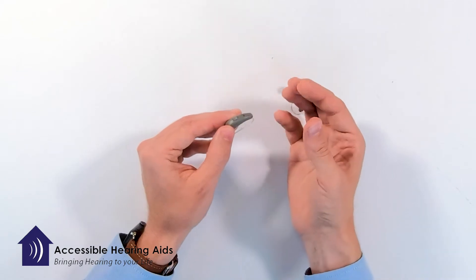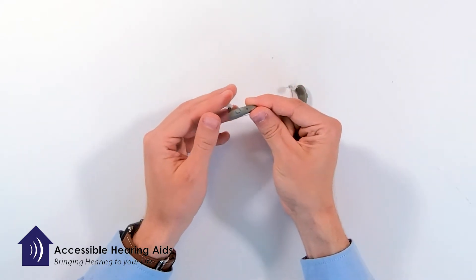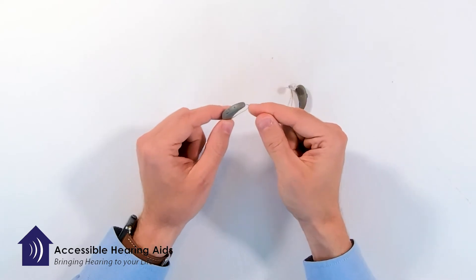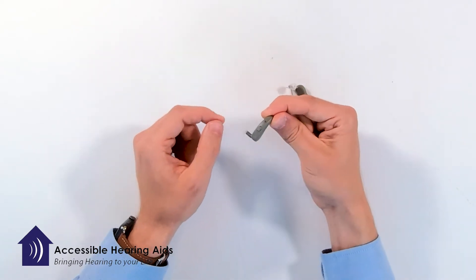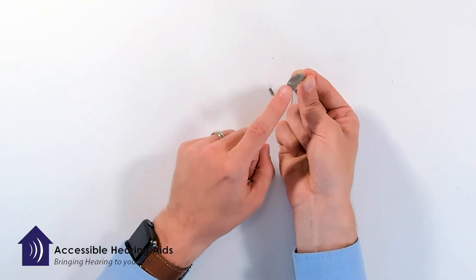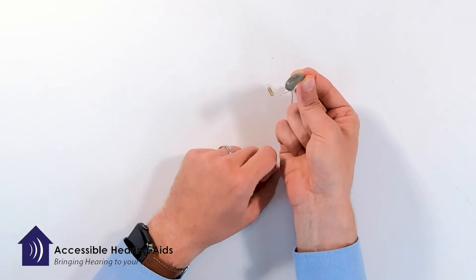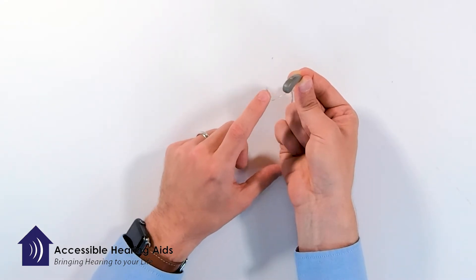I like to grip the hearing device between my pointer finger and thumb, pinching it right where the wire comes in contact with the hearing device. Holding it there, I point it back towards myself so that I can see the rounded bottom part of the hearing device, a space, and then the receiver.